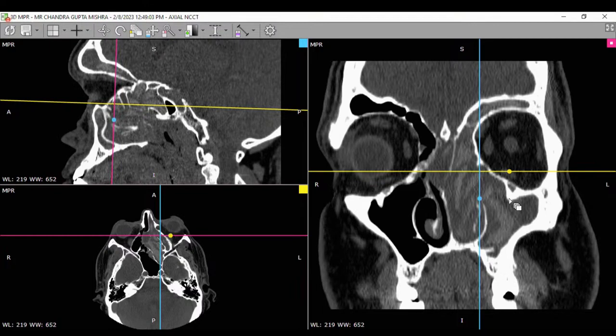Now we have a good avenue. We could see with a 0 degree. We will train the patient. I will show you tomorrow in the presentation how we train the patient to allow the secretion to go up. So this will go everywhere. That is a classical patient.